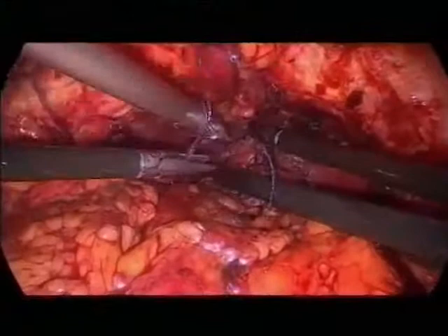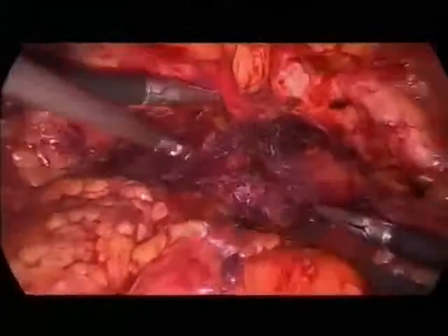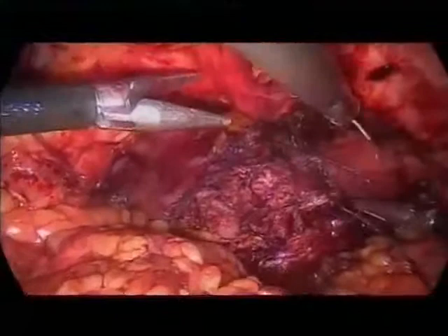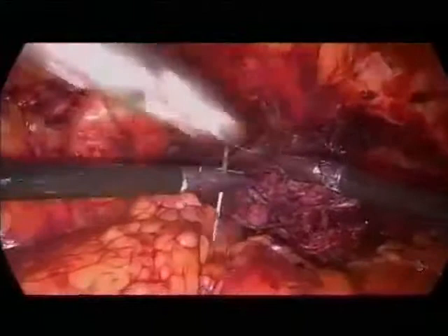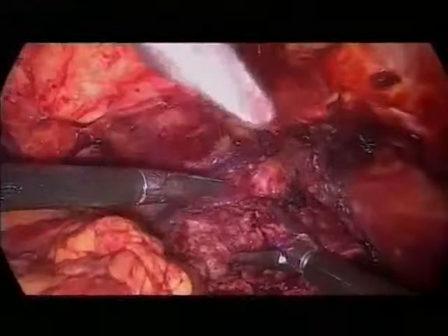Why not? Good. This was the stitch, and the next I would like to show is we use the same suture, go back, and we use this needle to go. This is the symphysis, and this is a kind of bladder elongation. Suspension. This is relatively easy to do. I hope it's understandable, but I think it's not very difficult.